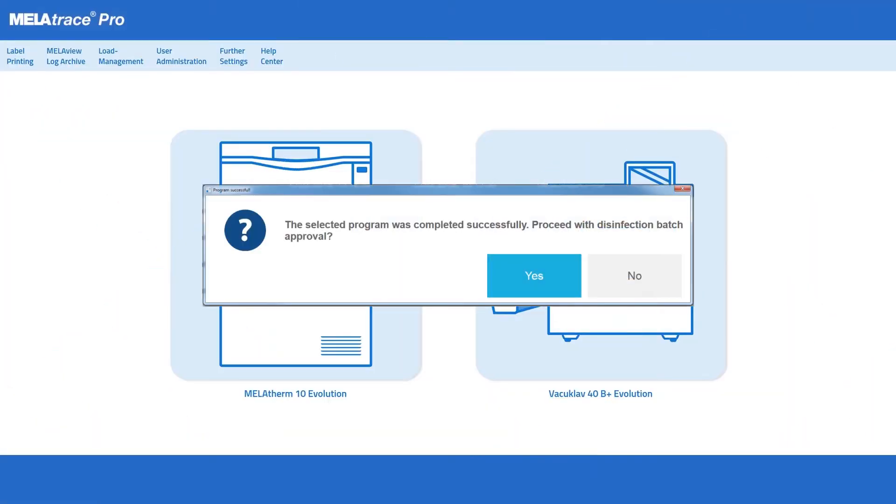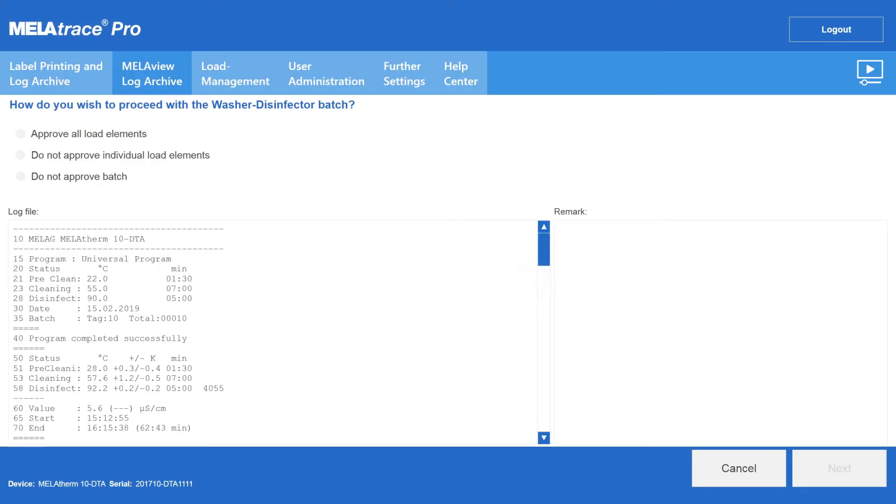Successful cleaning and disinfection with MELAtherm is followed by batch approval of the instruments.